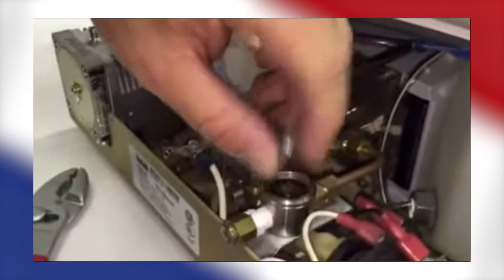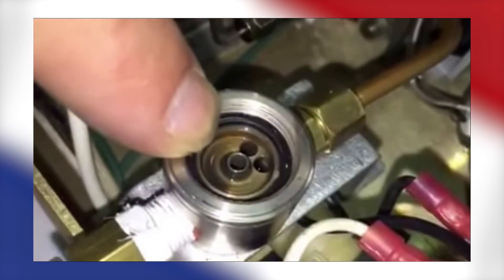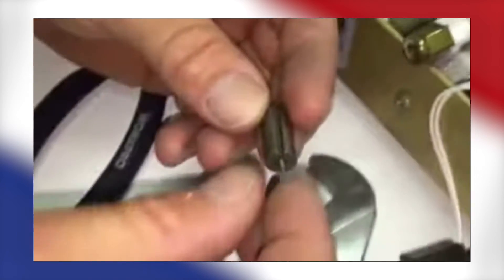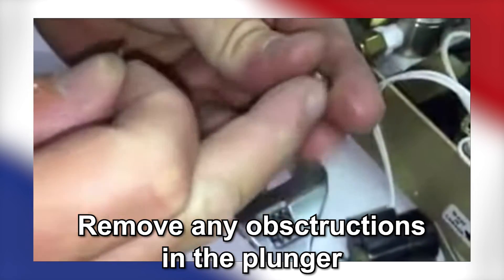Once the plunger is disassembled, check for anything impacting the plunger shaft or the socket you unscrewed it from. You can further disassemble the plunger to more thoroughly clean it. Remove any loose debris, hair, scraps, or any obstruction as needed.